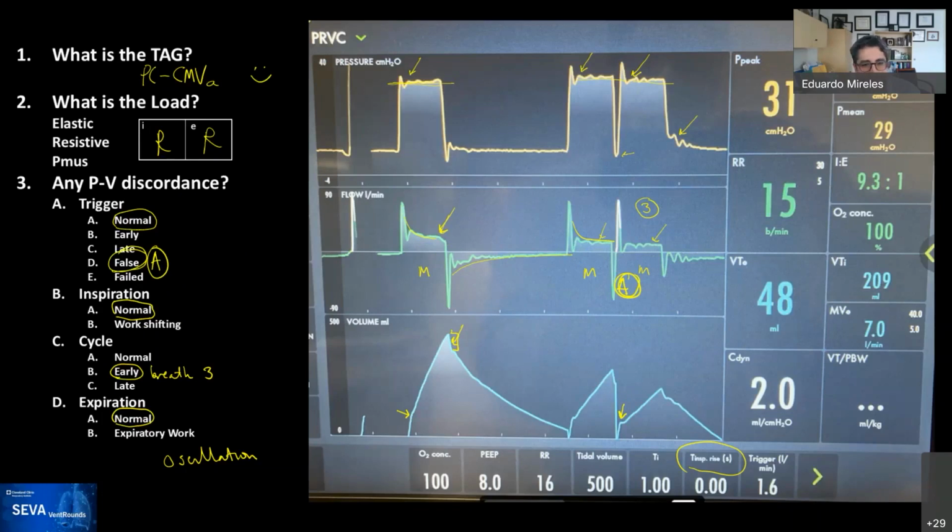A question about that, Eduardo. Yeah, go ahead. If you look at the discoloration, it goes from green to white, indicating it thinks that there's a patient signal. Yep. But the extent of that white doesn't seem like an awful lot. I don't know how to grade that, Rob.